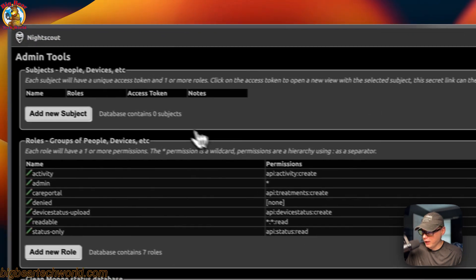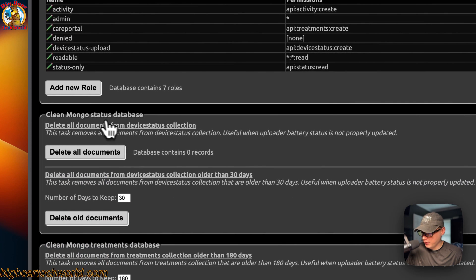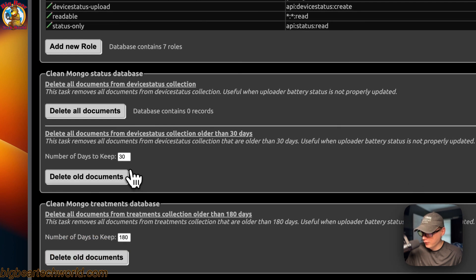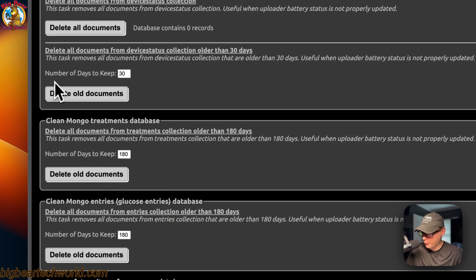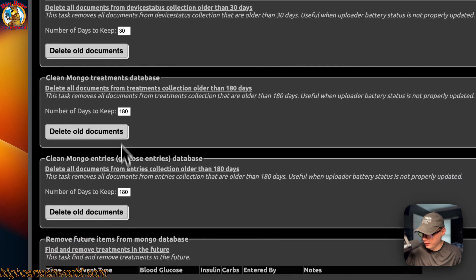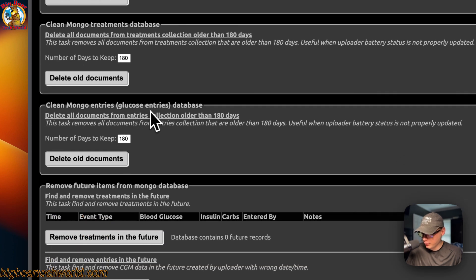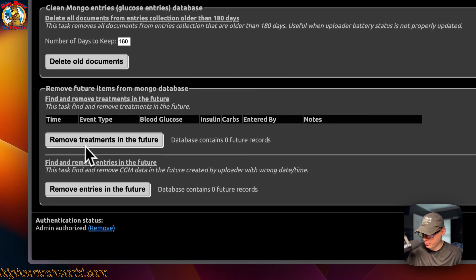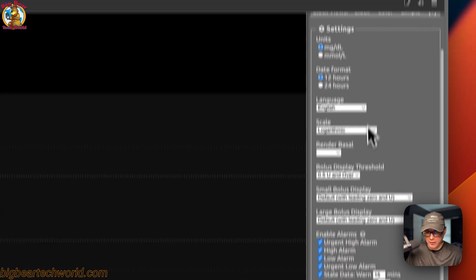In Admin Tools you can see subjects, people, devices, and add a new subject. Under Roles, you can clean the MongoDB database — delete all documents from the device status collection, delete all documents, set the number of days to keep (30 or 180), clean the Mongo treatments database, clean the Mongo glucose entries database, remove future items, remove future treatments, and remove future entries. You can also view clock view, color simple view, and settings.